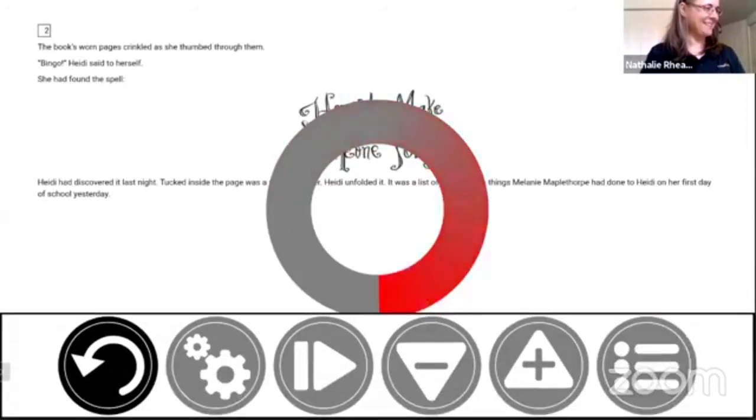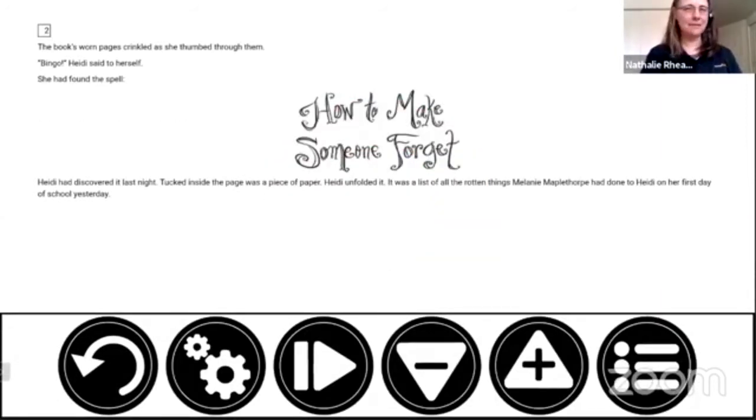Okay, so I think that's all I had to say about this new feature. Are there any questions?